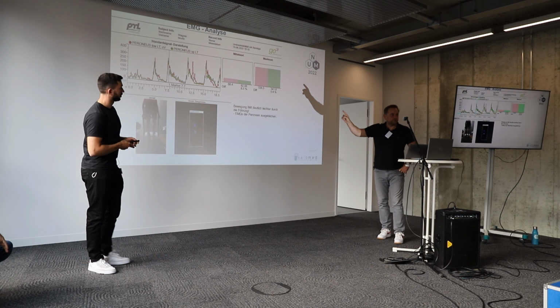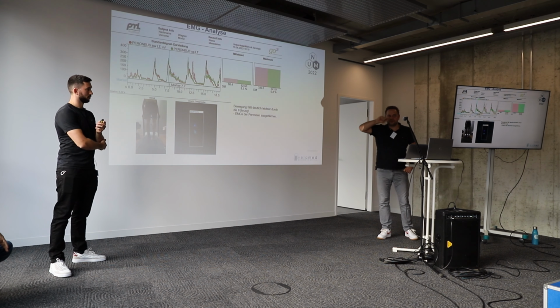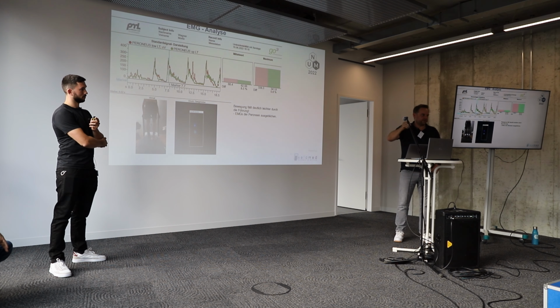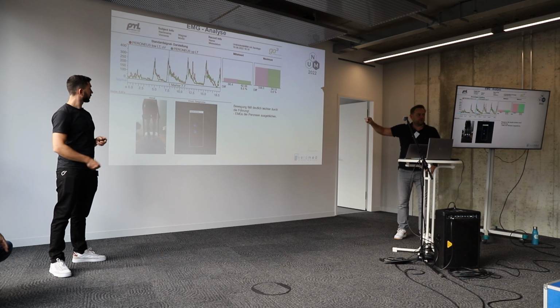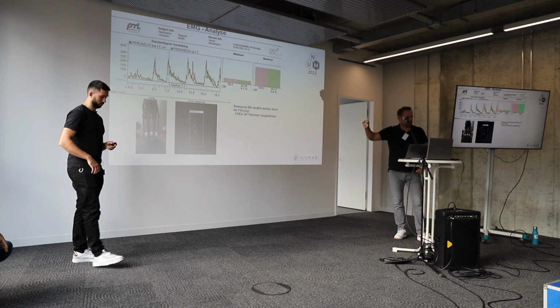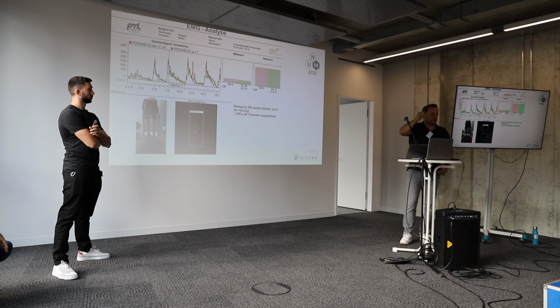So what we did then, or what Toby did then, was a biofeedback training so that he gets a feeling for his muscle. There's always a big discussion about using orthotics while doing proprioceptive training. The problem is if you have a ruptured lateral ligament, there is no proper proprioception because the proprioceptors are gone.